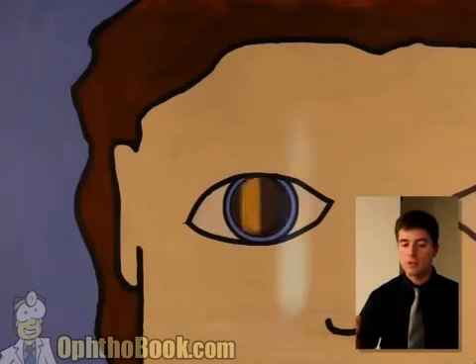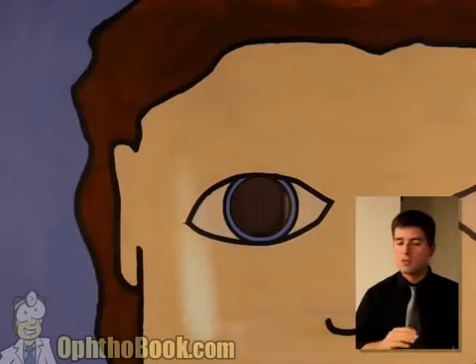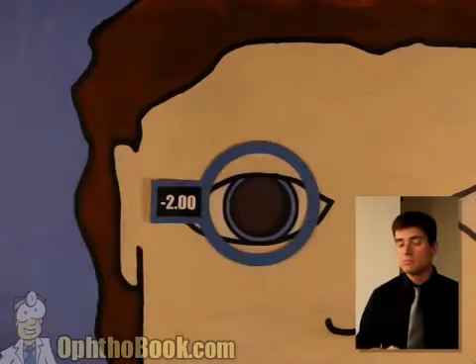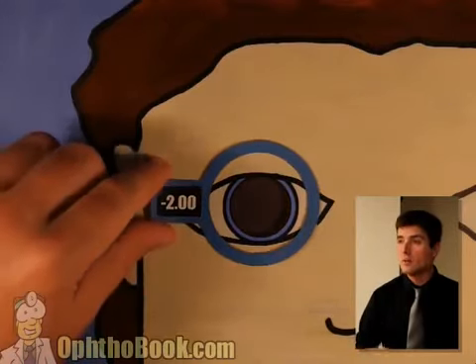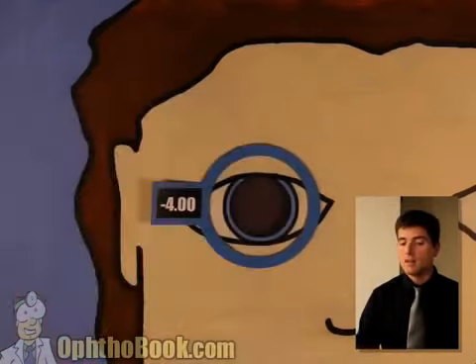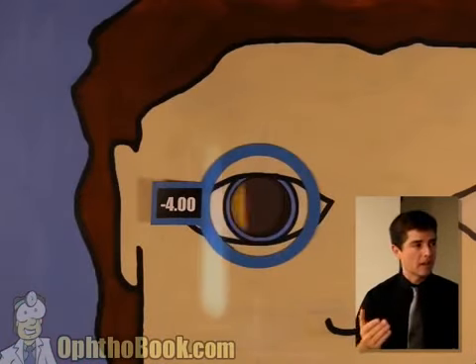I know I'm beating this into you, so I'm sorry. Start with against. This is no good. You can't have against motion. You got to have with. Still have against. This is no good. We got to have with motion. -4. Finally we have with motion.